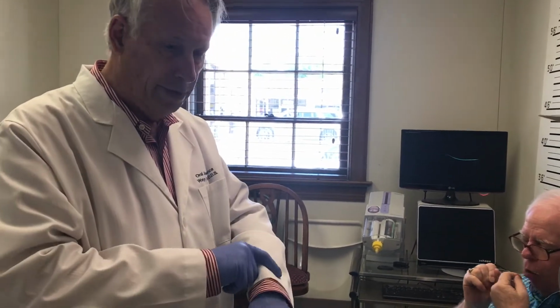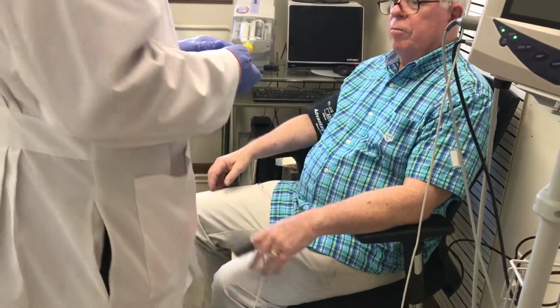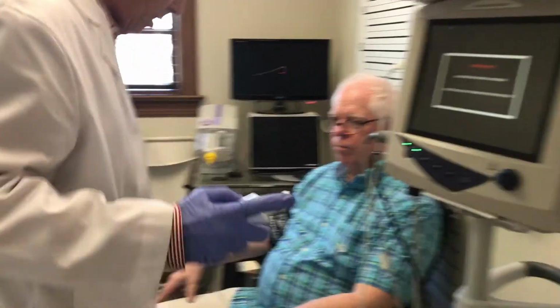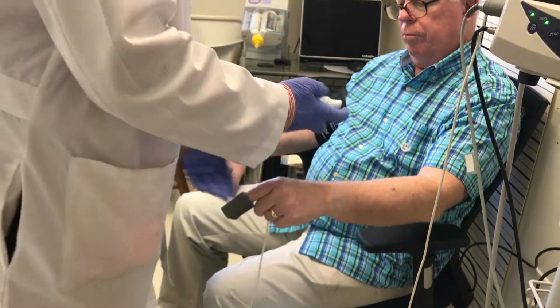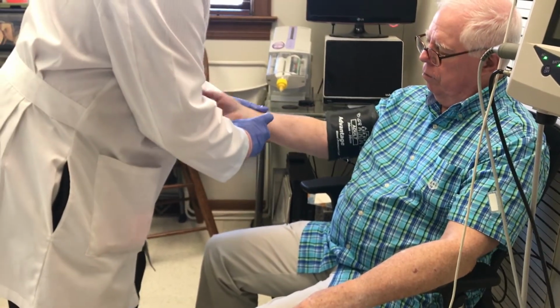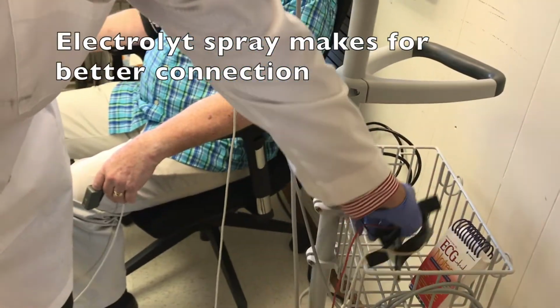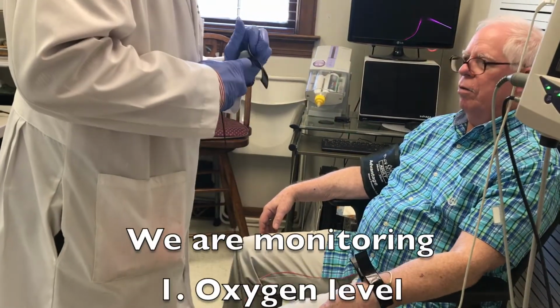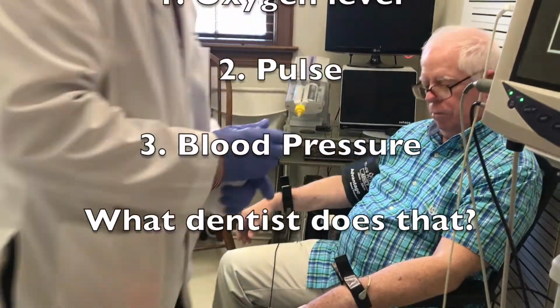We're going to put some wrist clips on for doing EKG, and we get a whole bunch of information in one fell swoop. Basically what we do is I spray his wrist so that the electrolytic fluid will touch his hairy arms and make contact with these clips. These wrist clips are non-invasive, and for the most part for what we're doing it does just fine.